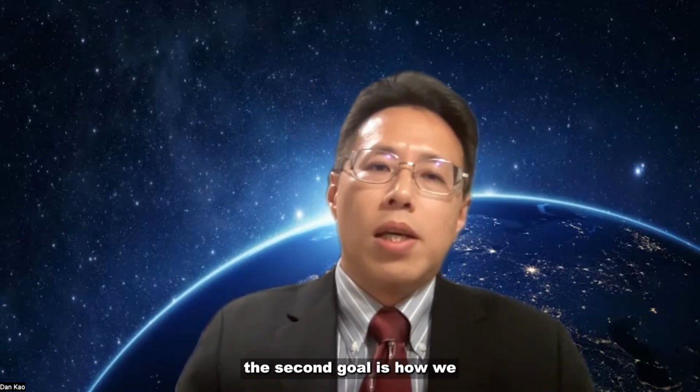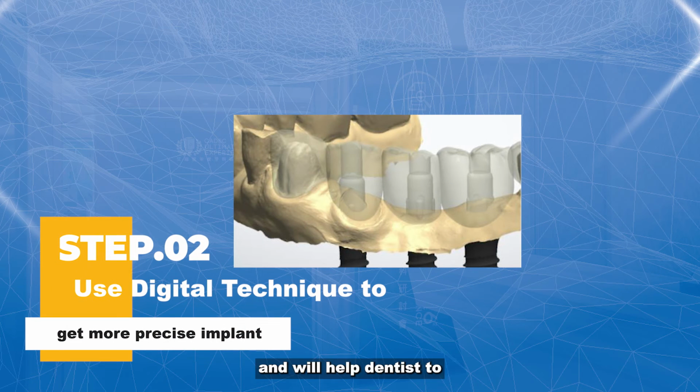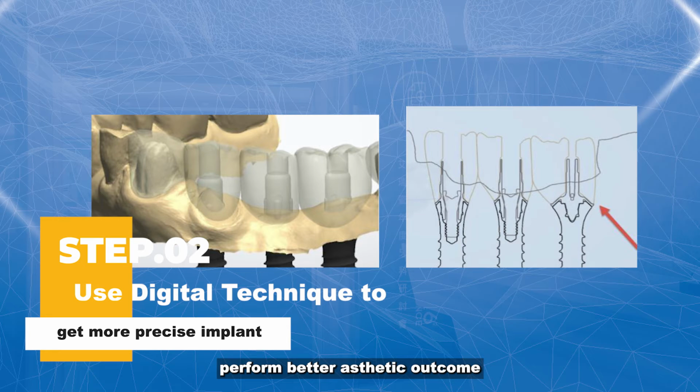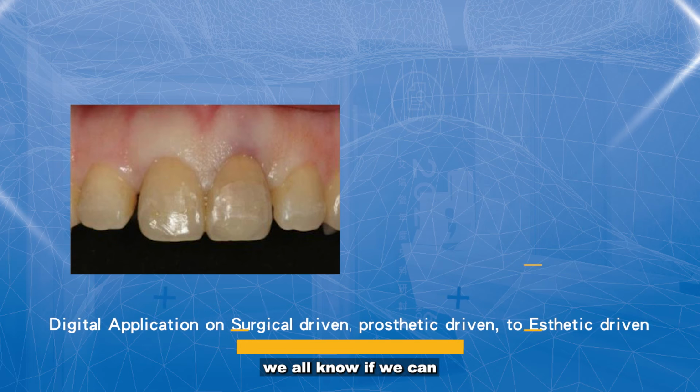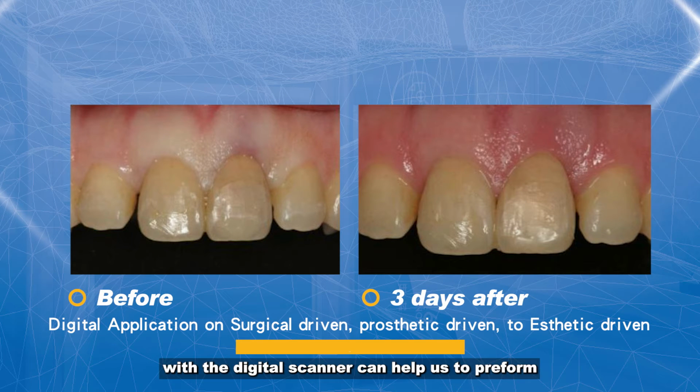The second goal is how we use the digital technology to help dentists to perform better aesthetic outcome. For example, when you place implant, we all know if we can have a surgical guide with the digital scanner, it can help us to perform a better outcome. But however, can we use this technology to help us design better prosthetic?